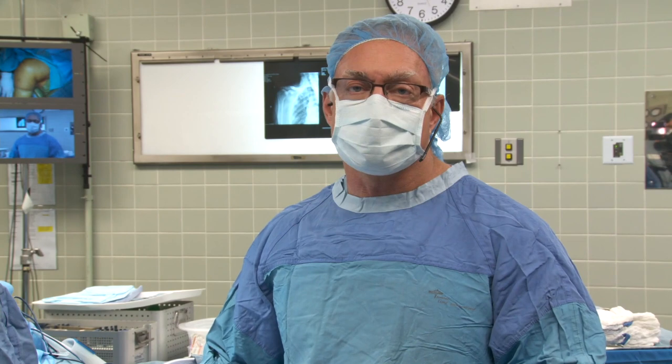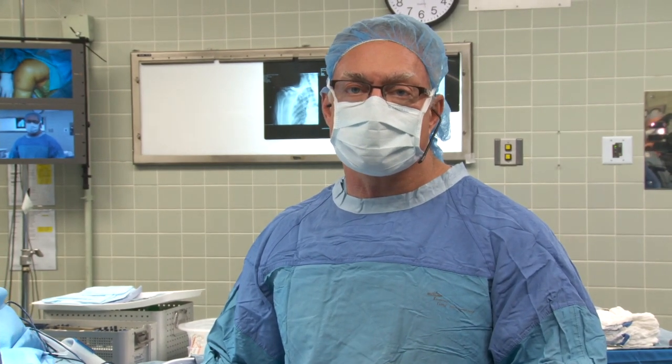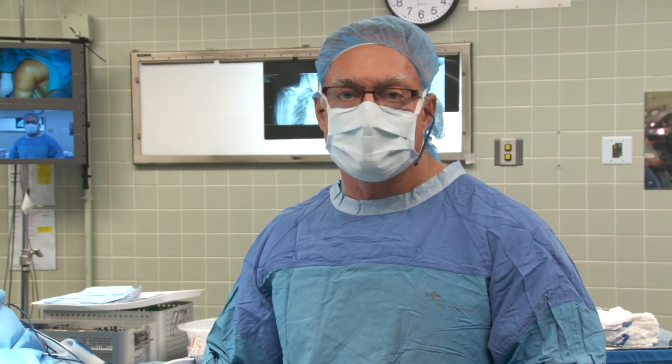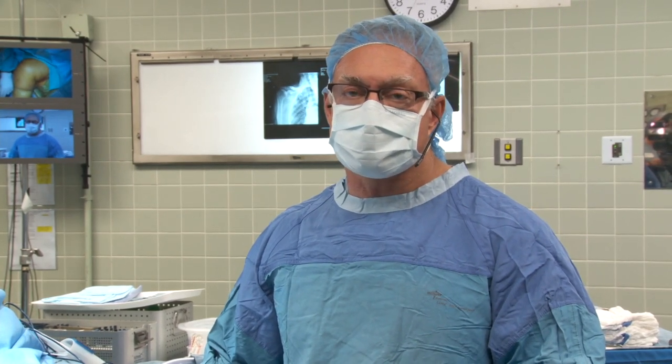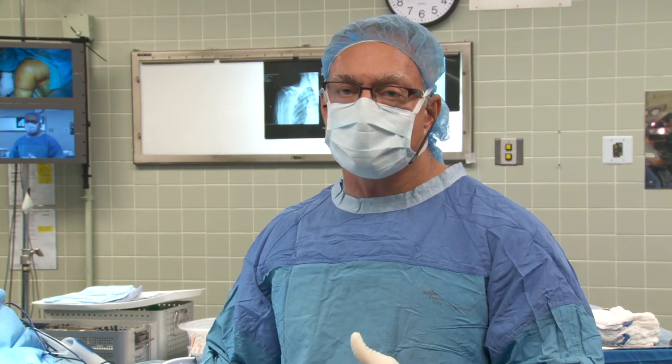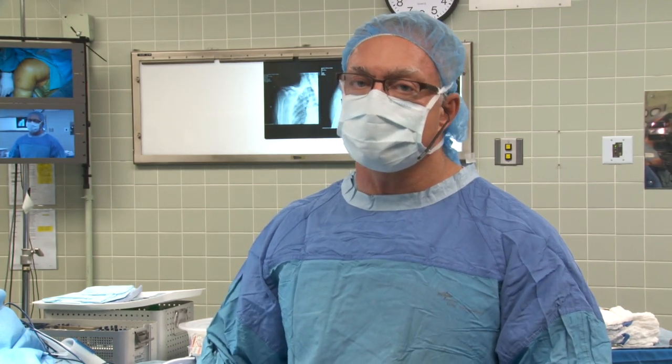Her supraspinatus has retracted back to her glenoid and her subscapularis has failed. We see on her x-rays that her humeral head sits in a subluxed position anteriorly. Because of her underlying problem with the deficient rotator cuff, our plan is to proceed with a reverse total shoulder arthroplasty. This should give her excellent pain relief and stability of her shoulder without worrying about the ability for the rotator cuff tendon to heal.